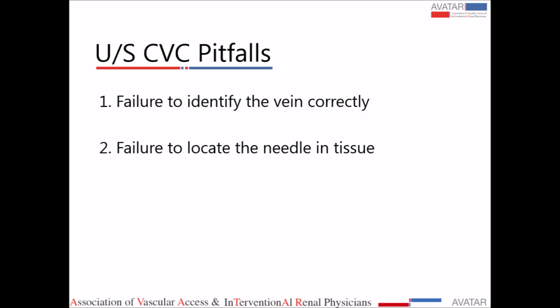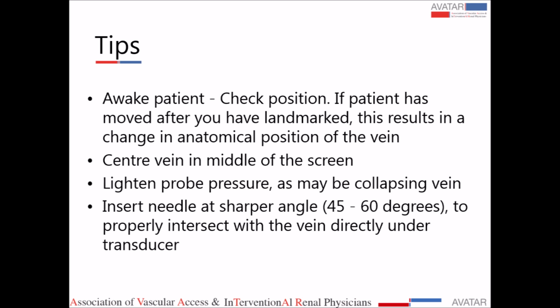There are certain pitfalls of ultrasound use. First, it may fail to identify your veins correctly, and there may be failure to localize the needle in the tissue. And there are certain tips for a successful ultrasound guided insertion. If you have marked and checked the patency of your veins, and after that the patient has moved a little bit, that will change the entire anatomy in the neck. So if the patient has moved, you have to check the vein and artery relation again.